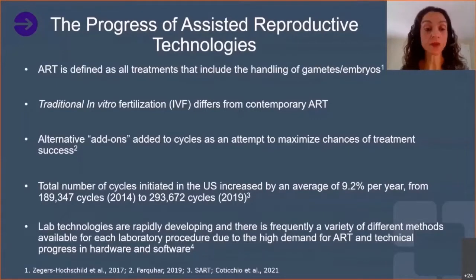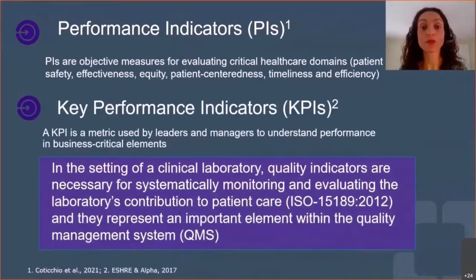And also, if you think about lab technologies, they have been rapidly developing, and there are frequently a variety of procedures and different methods available for the lab. Also, the high demand for ART and the technical progress we have been making in terms of new technologies, hardware, and software. So this leads us to performance indicators.